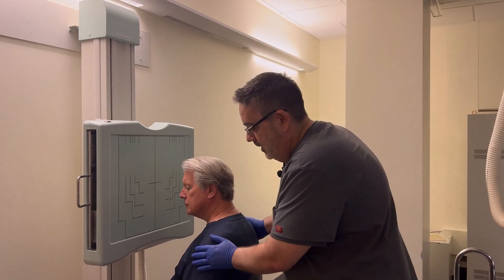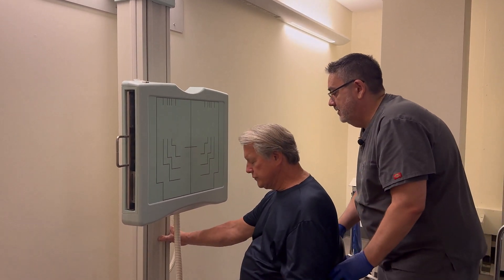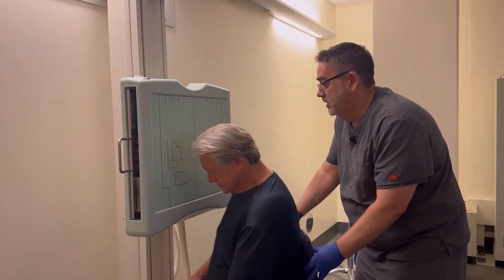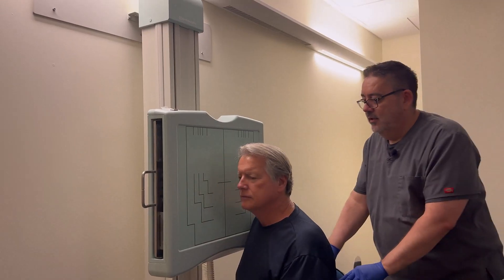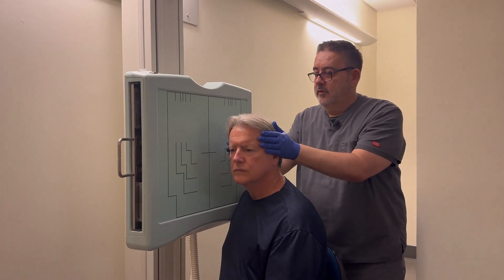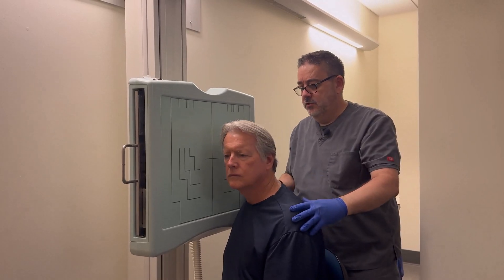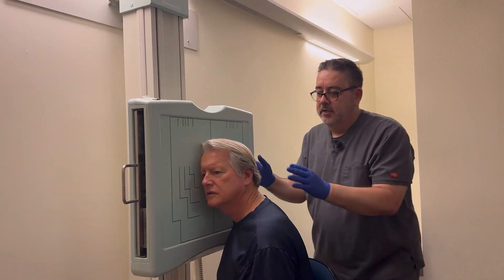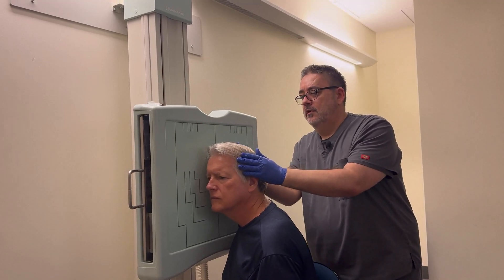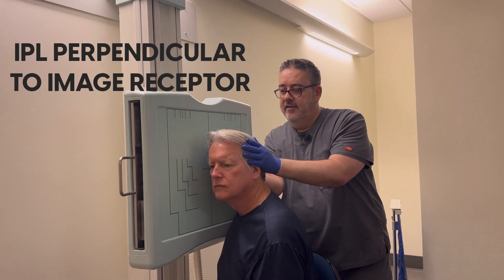Mr. Patient, can I have you back up just a little bit? We're going to turn you to the left, and now we're going to slide you towards the board. I'm going to have you turn and look straight at that door. I'm going to rotate your head a little bit. We're going to try to lean you in towards the board, and we're going to try to keep your neck vertical. I'm going to turn your head a little to the left.